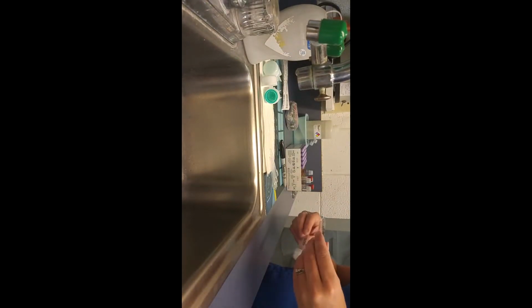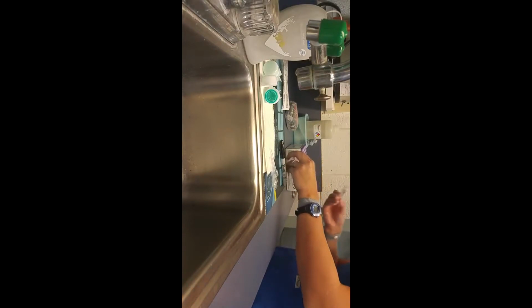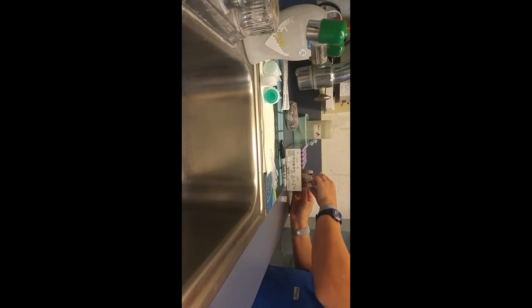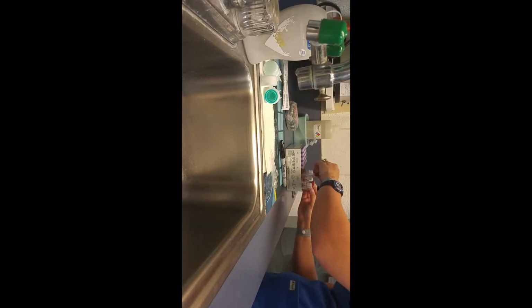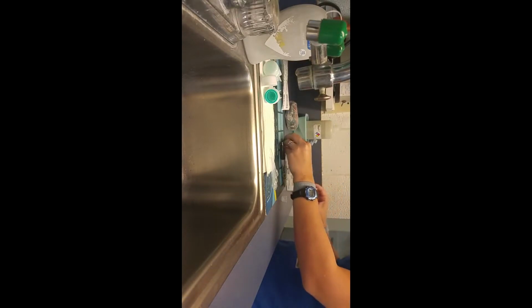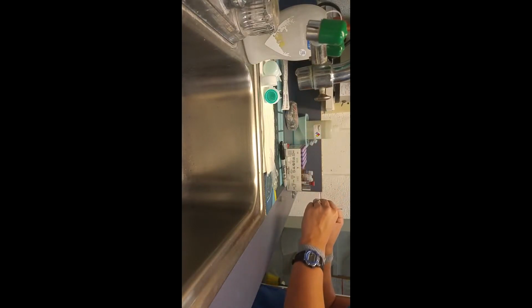So I've got two new labeled test tubes, and I've got my serum here, and I've got my washed red blood cells here. So in the first test tube, I'm going to take two drops of the recipient serum. I'm going to make sure that that's exactly what I'm grabbing. I'm going to pull the top off of that, and this should be the wash of the donor, which is correct. I'm going to take two drops of each, and I'm going to put it into that first.